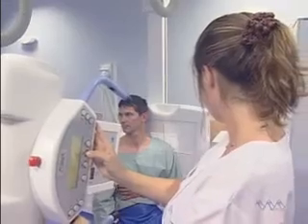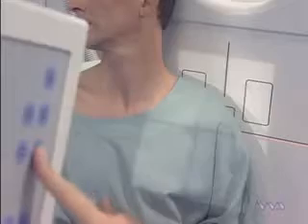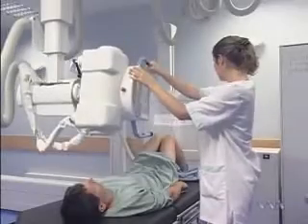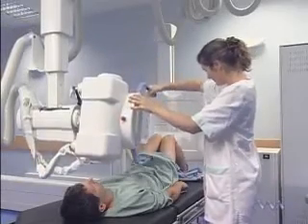The acquisition of an optimal image always requires the adjustment of the beam alignment and of the dimension of the irradiated area. The same is valid for femoral patellar articulations with the patient on a stretcher.